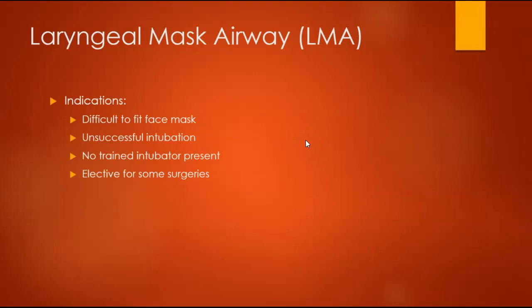Okay, so indications for use: if I'm having difficulty with just manually ventilating the patient with a mask, I would consider putting a laryngeal mask airway in. Again, after unsuccessful intubation attempts, or if there's no trained intubator present.